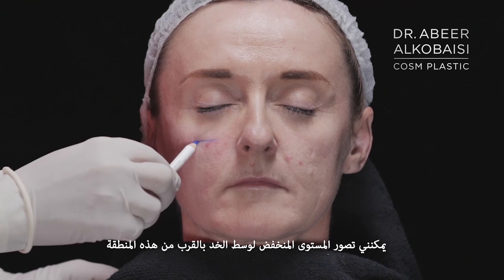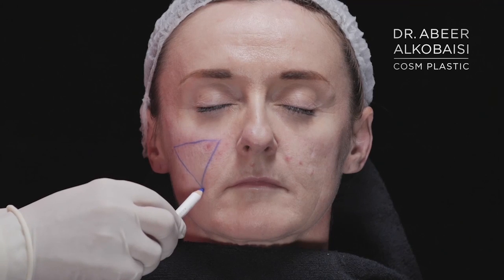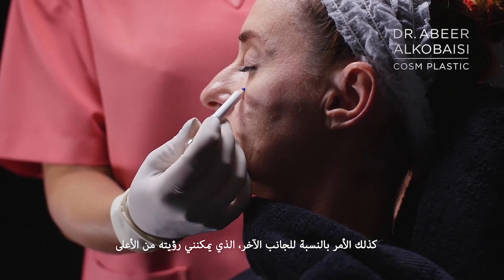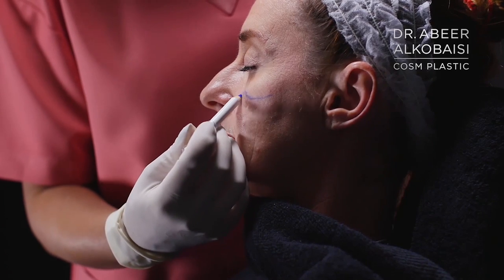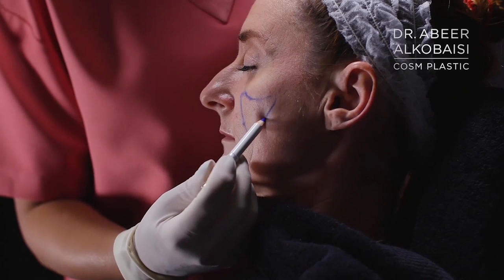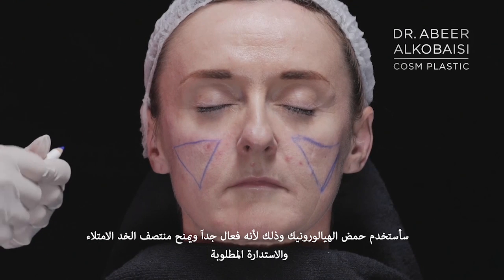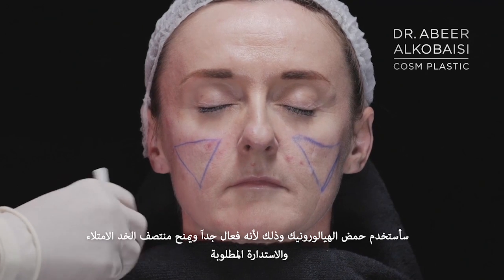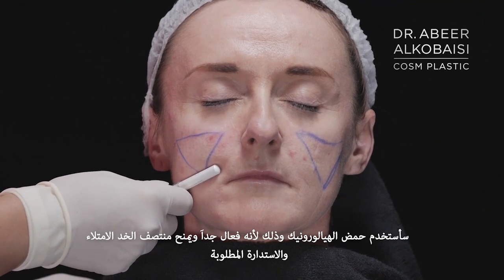So I can visualize the depression of the mid cheek, which is nearly here. Same on the other side, which I can see right from top. Here it is. I will be using hyaluronic acid. That is a bit strong enough to give the volume of the mid cheek, to give it the roundness that is missing.